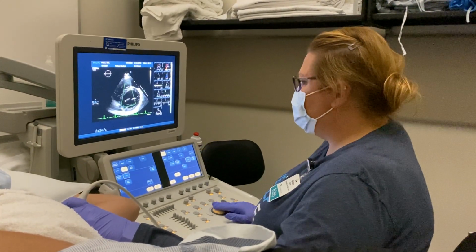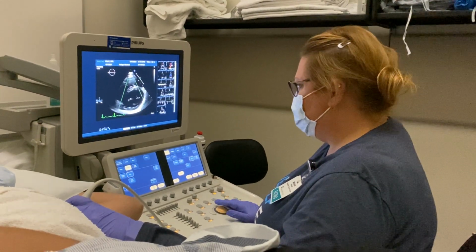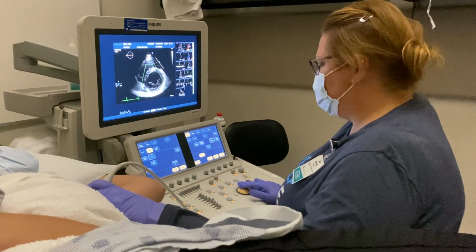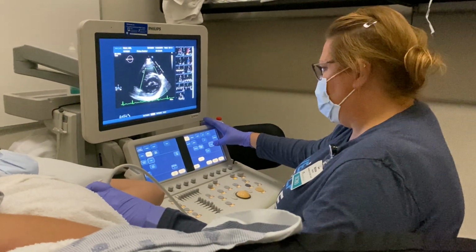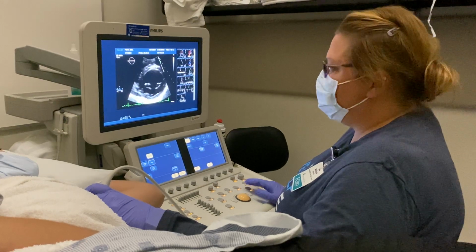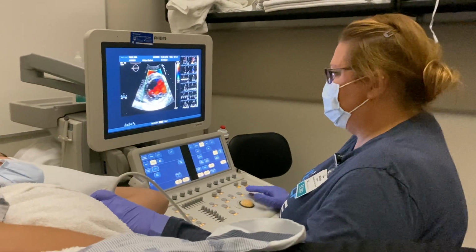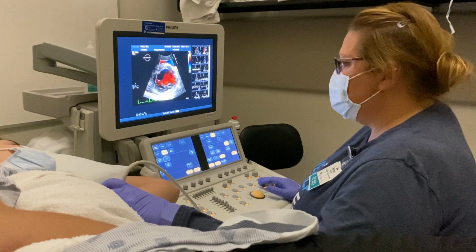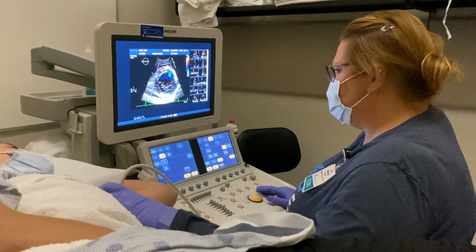Next picture is we really want to look at the morphology of our anterior and posterior mitral valve leaflet. We want to see what's happening. So I'm going to adjust the box around just the left ventricle here, and I'm going to click zoom. Both 2D and then a color image. And I'm going to adjust my box again so it's a little over the ventricular septum in case I've missed a muscular VSD or there's inlet VSD present.